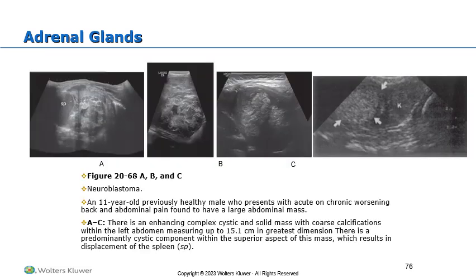So here's a couple examples where, I think this one is probably most prominent, here's the kidney. We see this large mass separate from the renal cortex. So we can make out the renal cortex all the way around here. This is separate to it. Then, of course, once they do the biopsy, they'll be able to determine which type of adrenal mass it is. But the clinical symptoms of hypertension and other things, those fight or flight sort of responses, are going to probably point them in the right direction before they even get the biopsy done. Here you can see just how large these can get. Here's one with a little area of necrosis in the center because it's outgrown its blood supply.